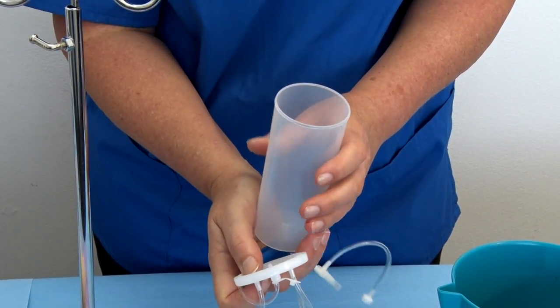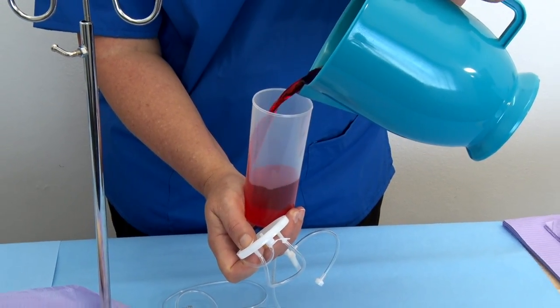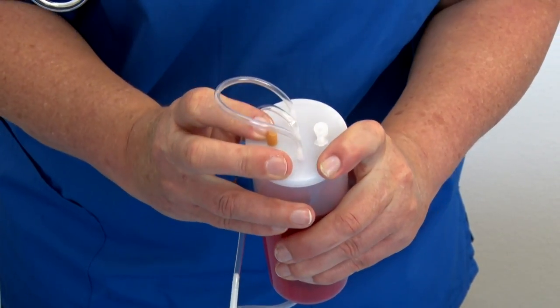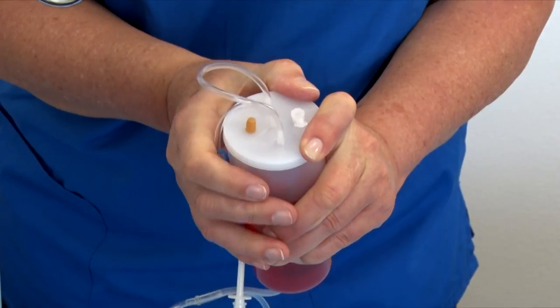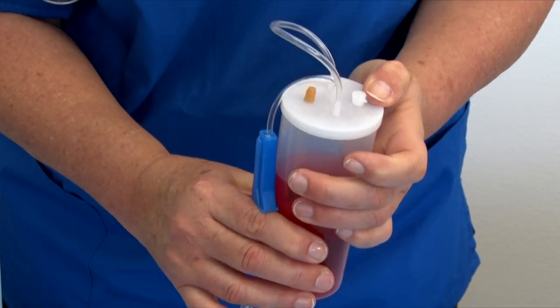Step 10: Open the lid of the reservoir container and fill it about two-thirds or three-quarters with regular water, colored water, or saline. Step 11: Cover the lid securely — if the lid is not secured properly, it may slip off unexpectedly during a practice session and cause a great mess.